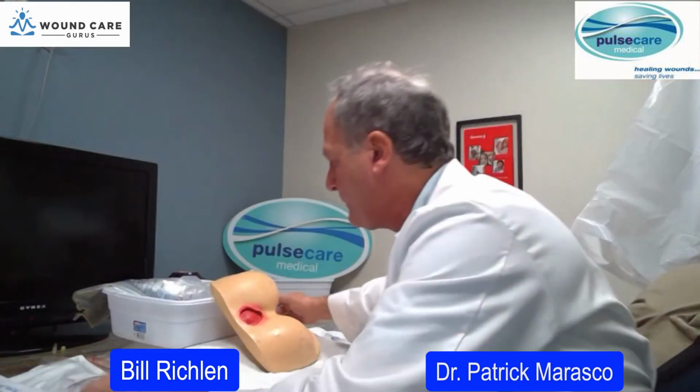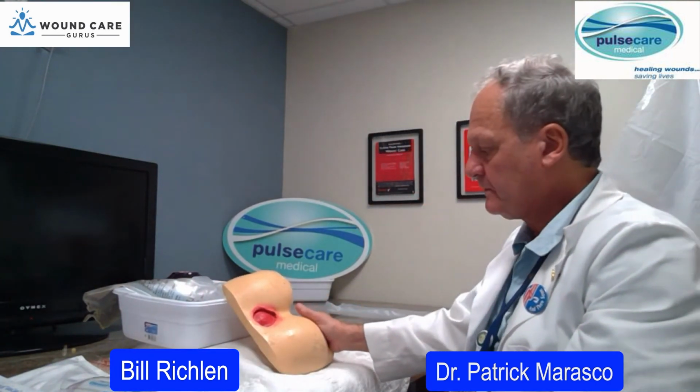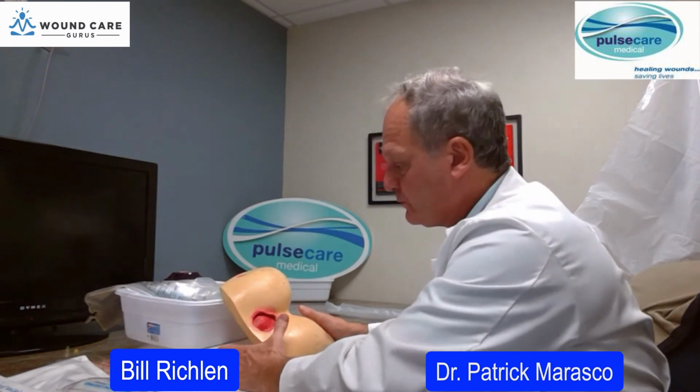Well, what you have is a system that comes packaged individually, and what the practitioner would do is set the patient up at the bedside, bring the patient a little bit closer to the edge of the bed. Right now, it's on a conference room table.